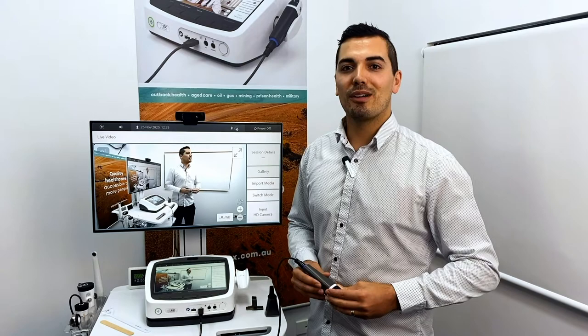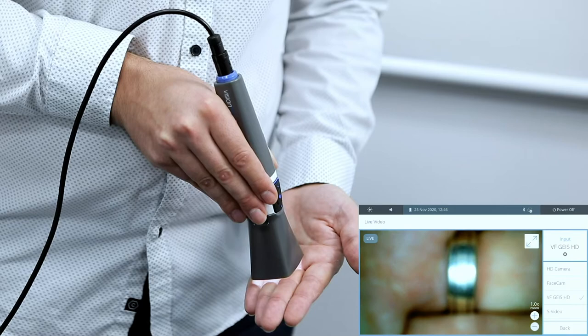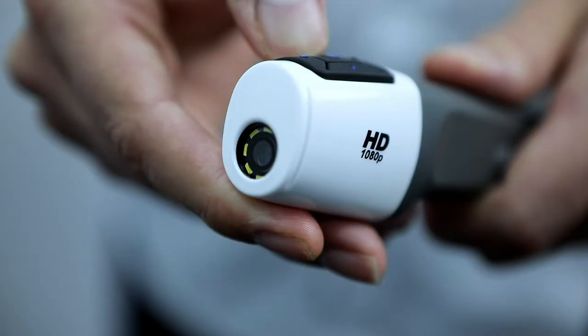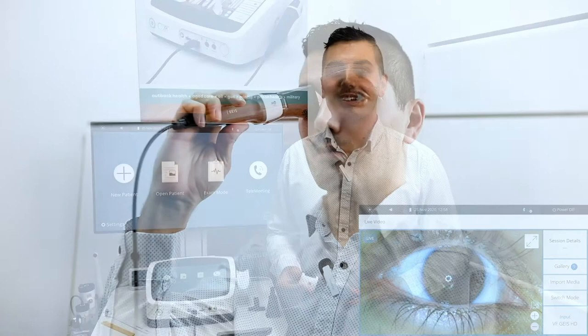Select the GEIS camera from your input list in live video when it appears. The GEIS camera features default autofocusing with the option for manual focus mode, 4 brightness levels for the inbuilt LED light source, lightweight design with single button snapshot and full HD 1080 pixel resolution.